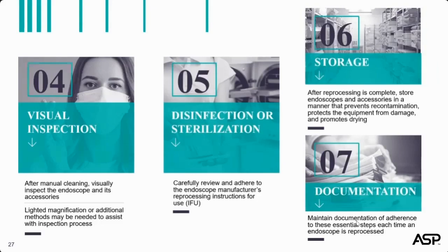Identification of persons doing the reprocessing, who put it in, who took it out. Lot number of the reprocessing solutions. Disposition of defective items or equipment. Maintenance of water systems. So are you keeping a log sheet on maintenance of your wall filters or your internal filters on an AER? Endoscopes and endoscope accessories. Are you keeping a log as to what you have in inventory, what's gone out for repair?